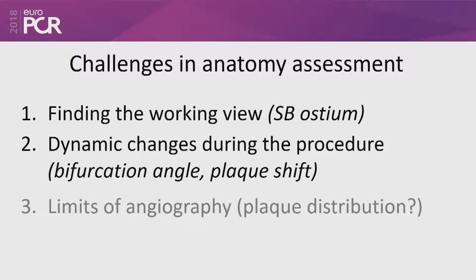The second is that as you proceed with the procedure, the anatomy may change, and you will see this as well. The third point is something which has been talked about in the previous lecture, and this is intravascular imaging. It does expand our knowledge about the anatomy. It is not a gold standard yet, but in some situations, as for example ostial LAD plaque, it can help us guide the procedure. It can tell us where the plaque ends, how long it stretches back into the left main.